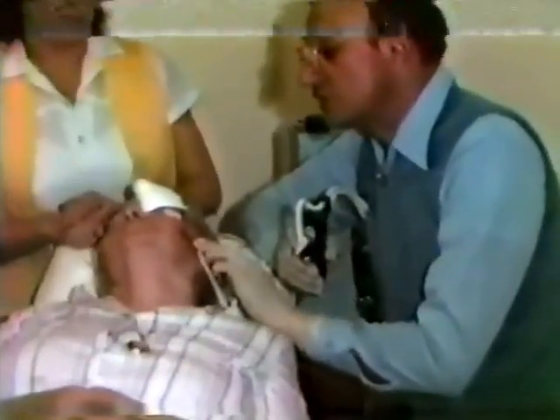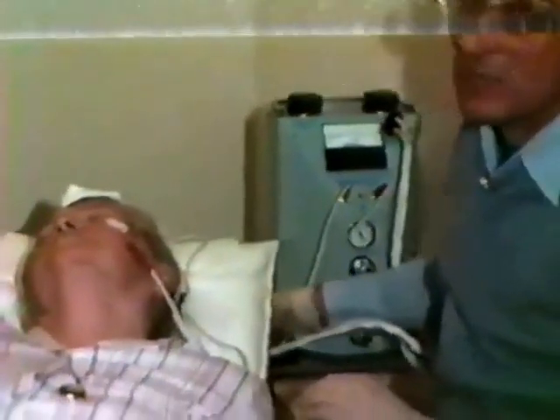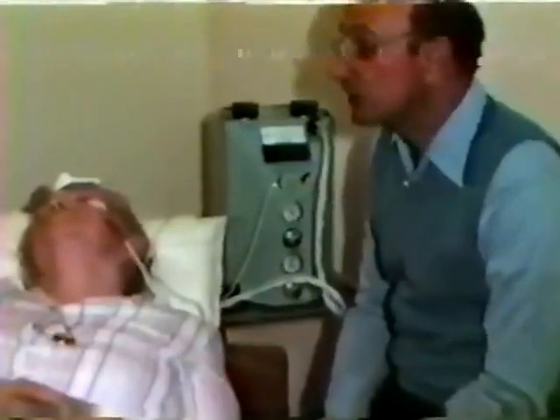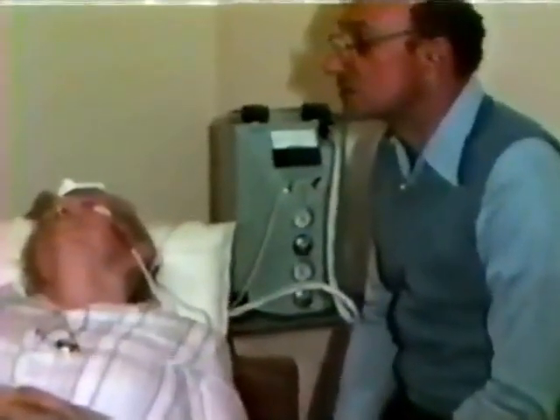We've frozen this tumor down to approximately minus 40 degrees centigrade. As you can see, we have a margin of normal tissue approximately 5 to perhaps 8 millimeters around the tumor. And this way, if there's any microscopic portions of tumor that I cannot see, we will certainly get rid of it. This freezing procedure took about 2 minutes. Now we have to wait for this to thaw. And the thaw time will be approximately 5 or 6 minutes.